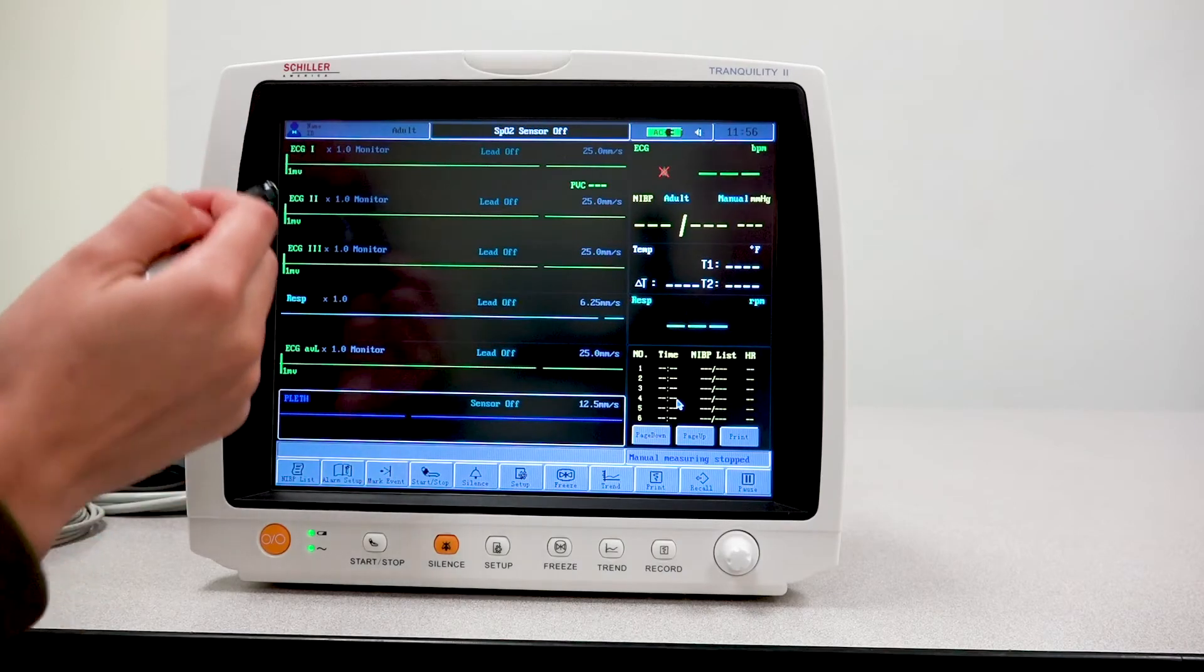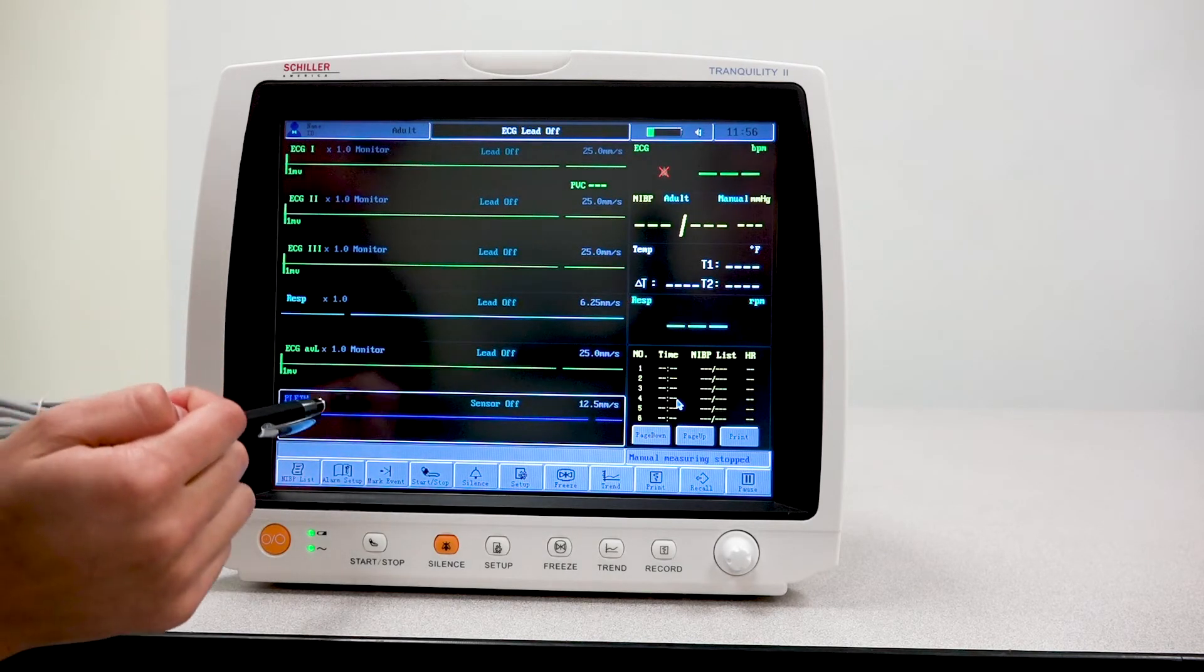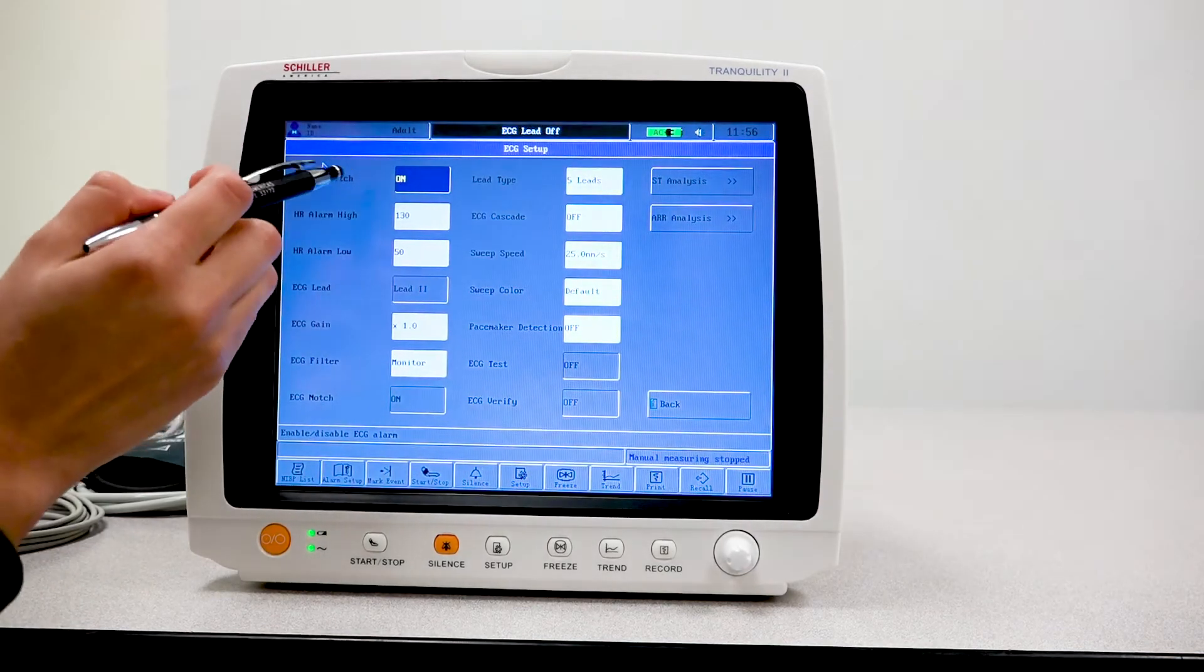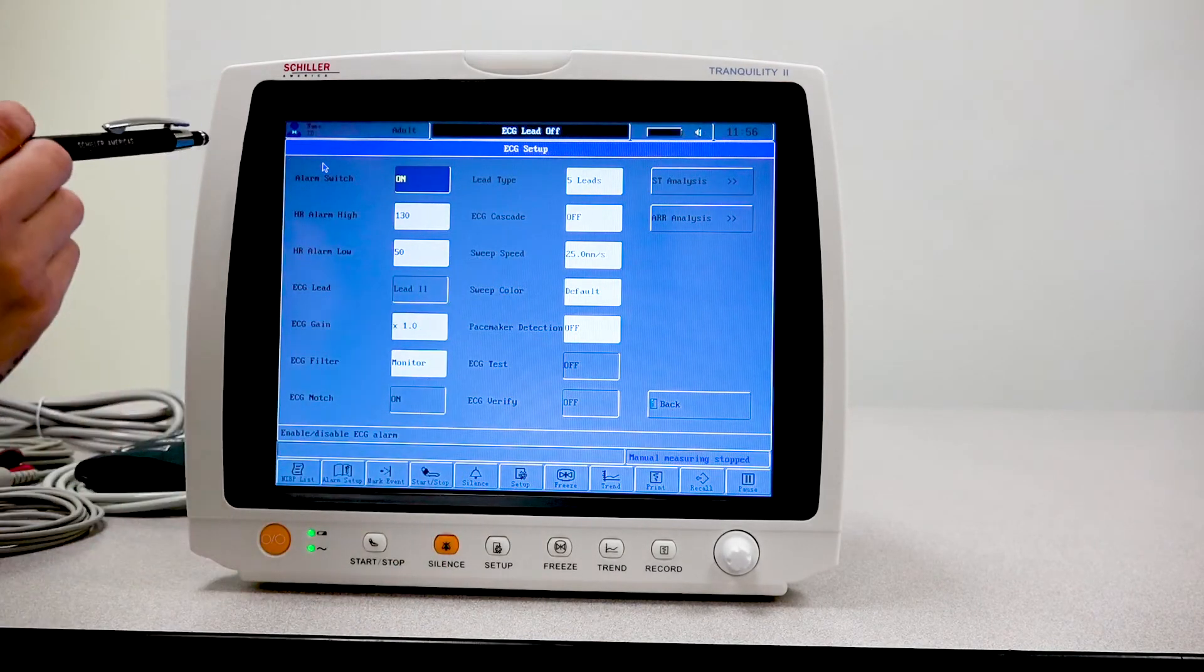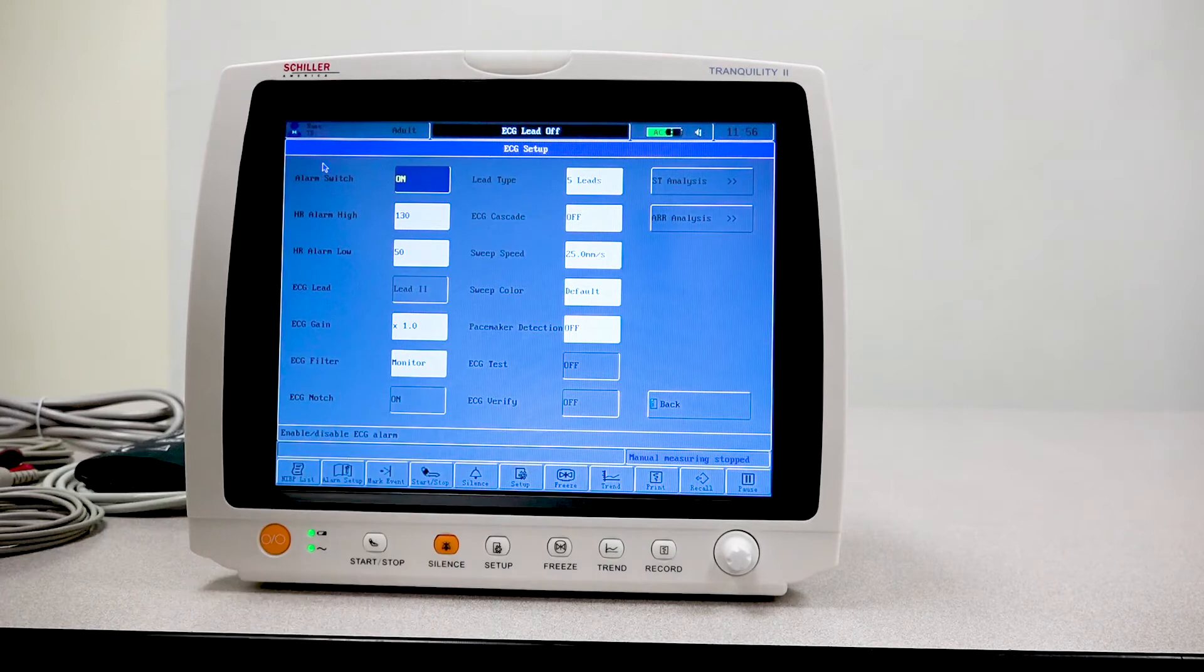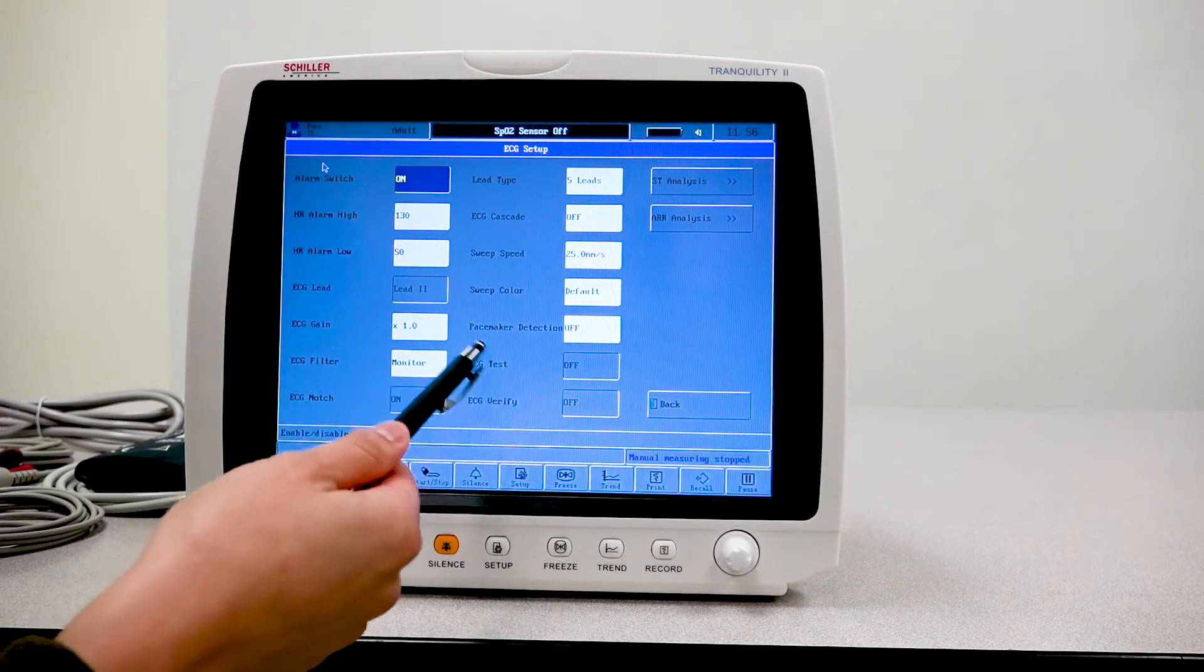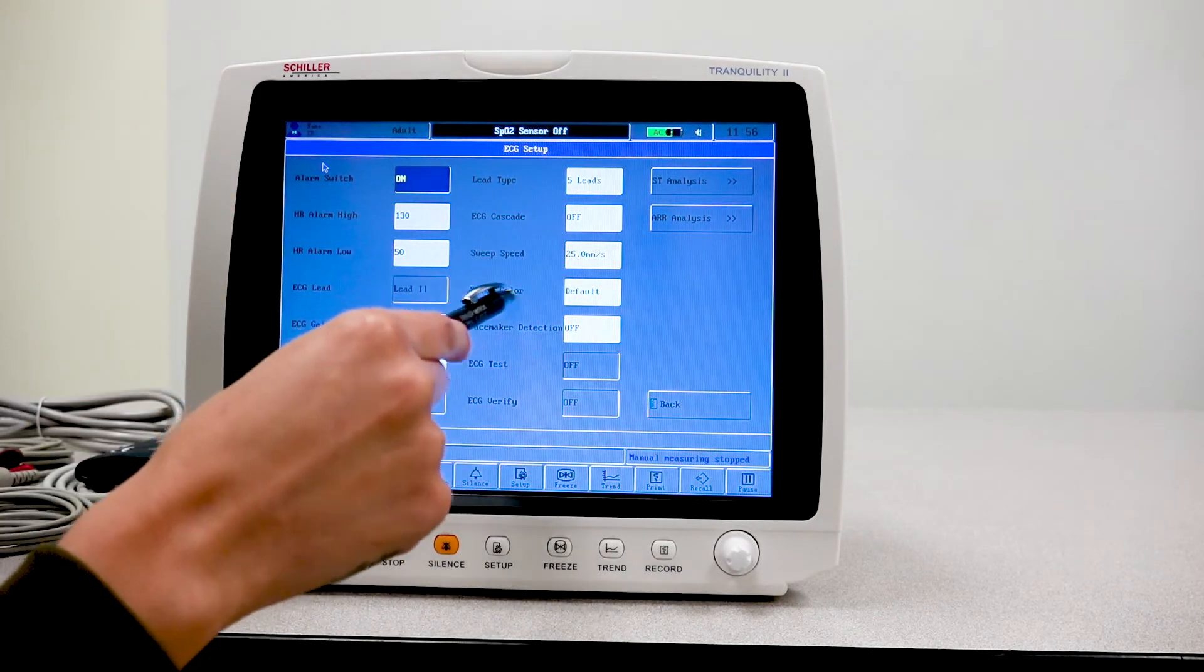Once in your main screen here, you're able to click on each waveform section and actually change the setting of that particular waveform being displayed. If I was to just press on the top waveform, I will then have all of the different settings or options that I can set that particular waveform to, such as my alarms, the filters, the sweep speed, how fast I want the waveforms to go.